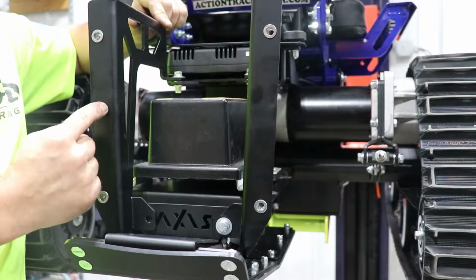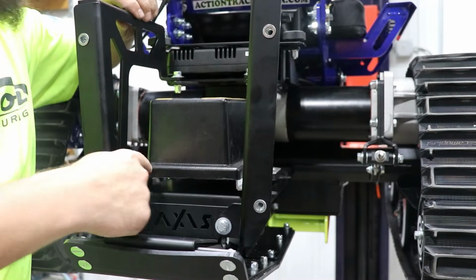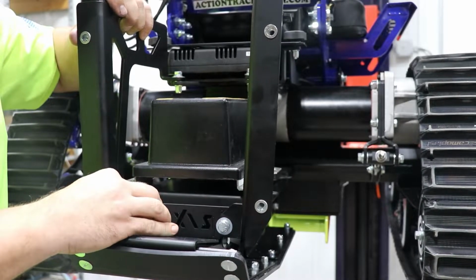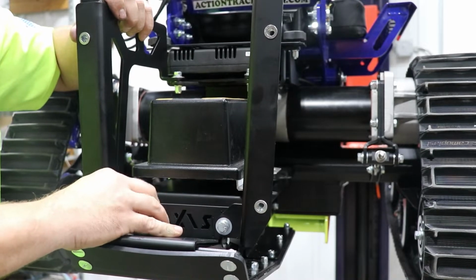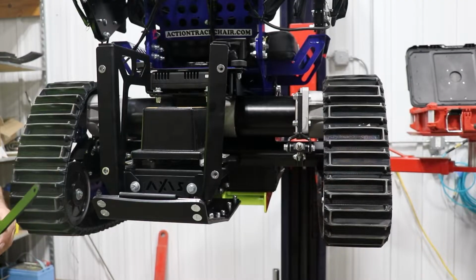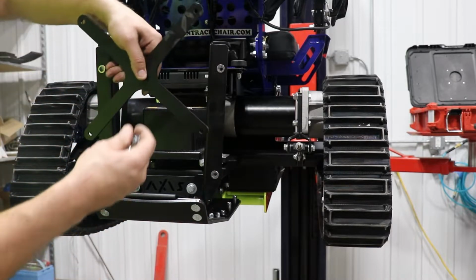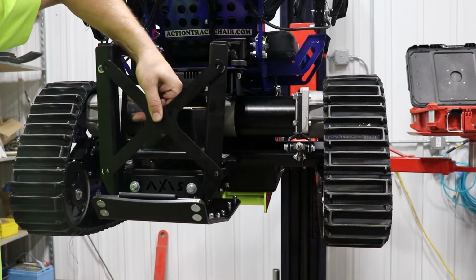Install your sides with this lip facing towards the outside. Start here, come down here. Take your last 4 hex-headed bolts with the same hardware and install the X brace on the back. It only fits one way.